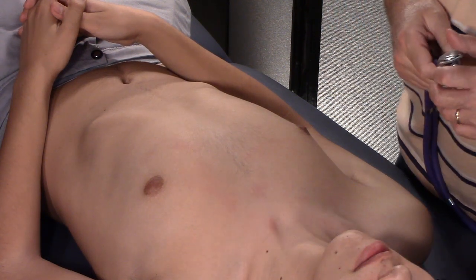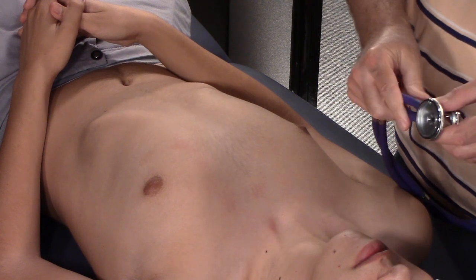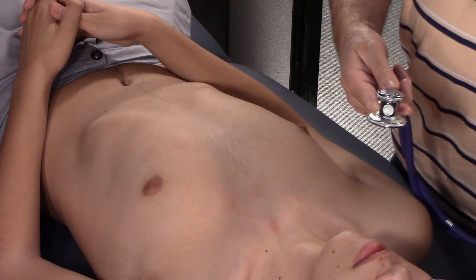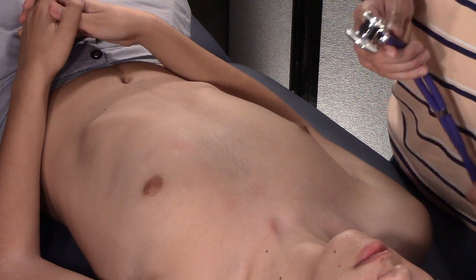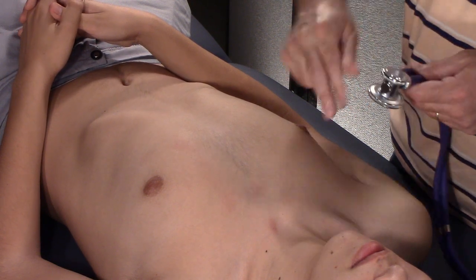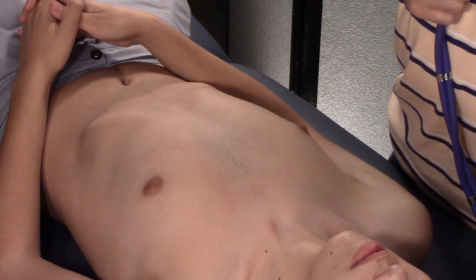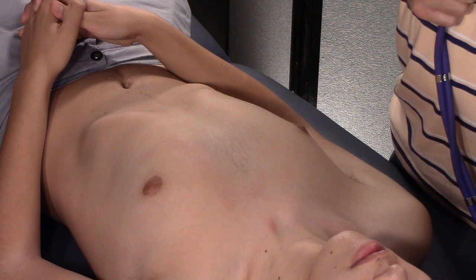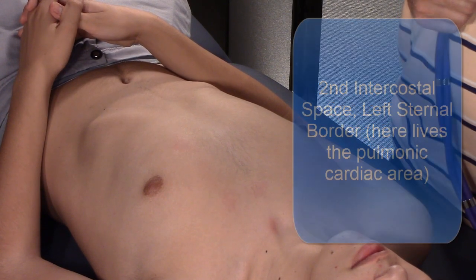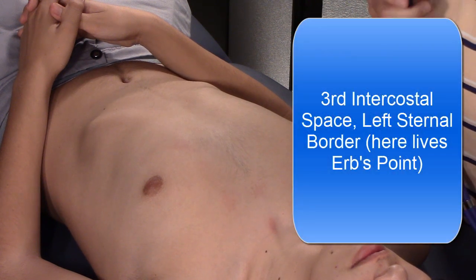In the last video we talked about finding the apical impulse, so go watch that one. We'll be using the stethoscope diaphragm — it's what most people use. To auscultate the cardiac regions, you use a Z pattern — like Zorro. The mnemonic is APEC monkey: Aortic for the aortic valve, Pulmonic for the pulmonic valve, Erb's point at the third intercostal space left sternal border — a nice vantage point where you can hear murmurs and both the aortic and pulmonic valves, and the rhythm of the heart.